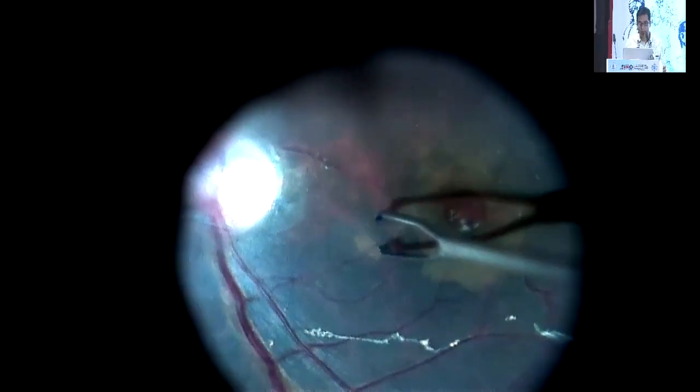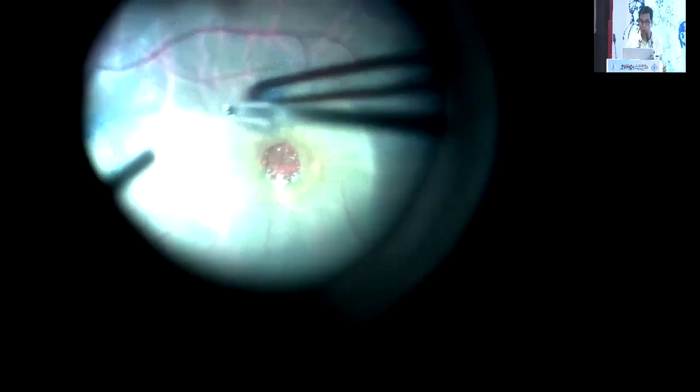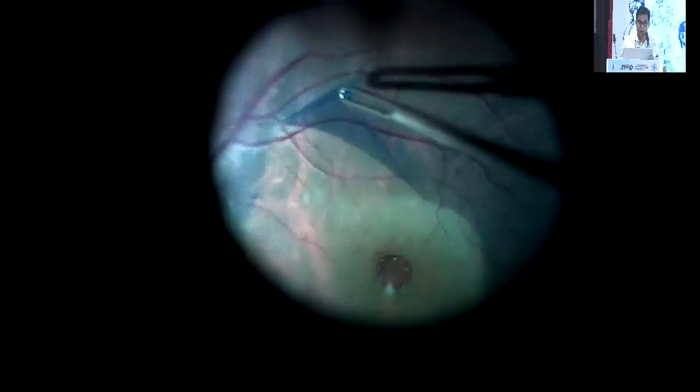The initial steps are very similar to what we routinely do. Obviously, we do a complete vitrectomy, induce PVD, and ensure that a good vitrectomy is done initially. Then, of course, stain the ILM with BBG, take off the excess BBG, and then routine ILM peeling is done. In larger holes, it is a good idea to do a slightly larger peel, and it is very important to remove the ILM from around the edges of the hole, enlarging the area of ILM peel a little bit.